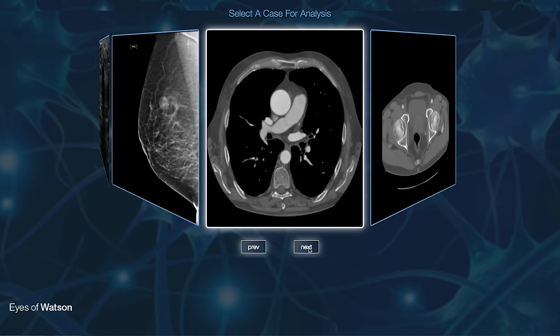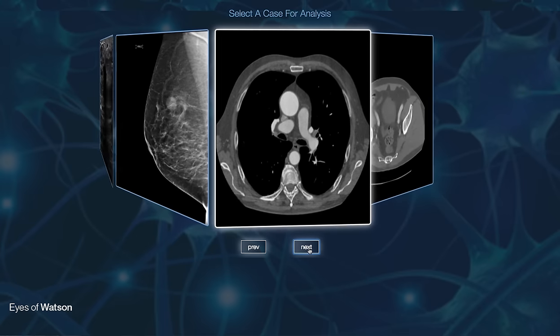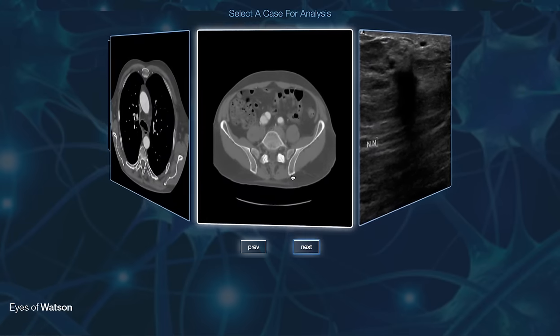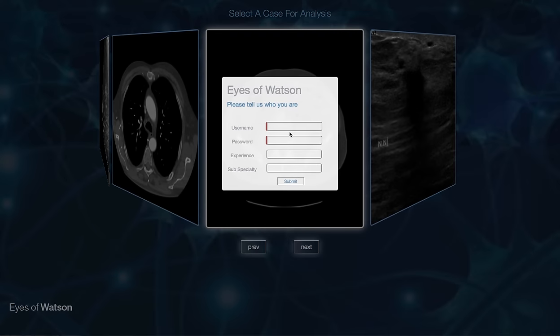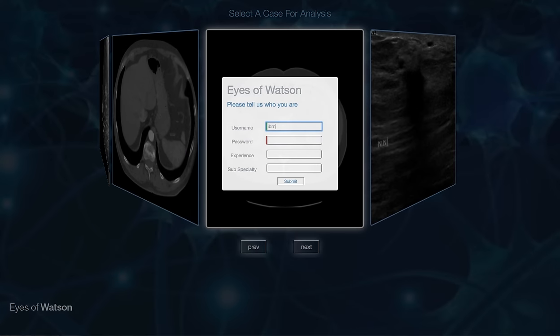To experience the eyes of Watson, you can select a case for analysis. After verifying your credentials, you will be presented with the case.